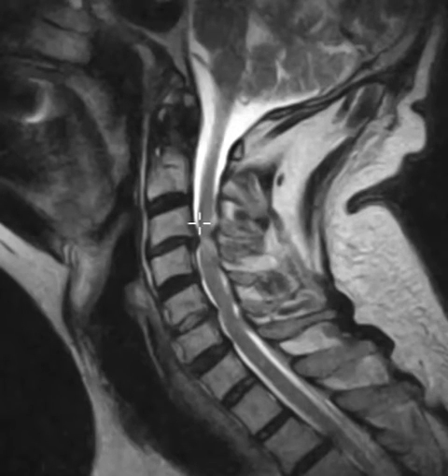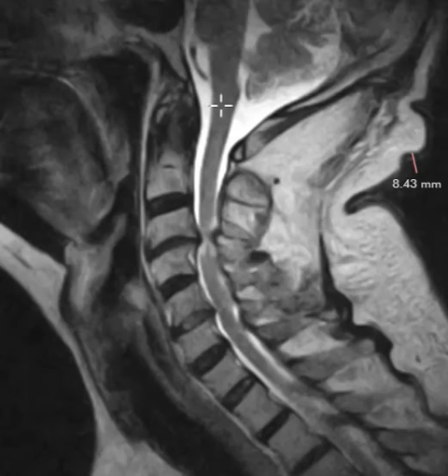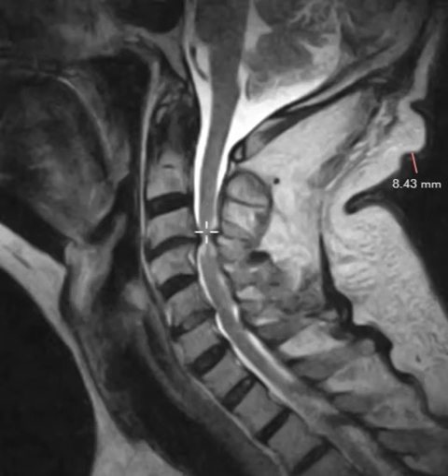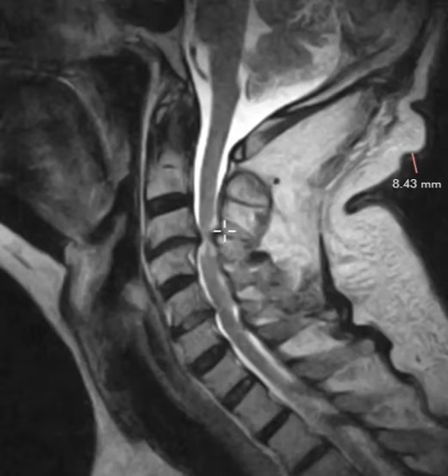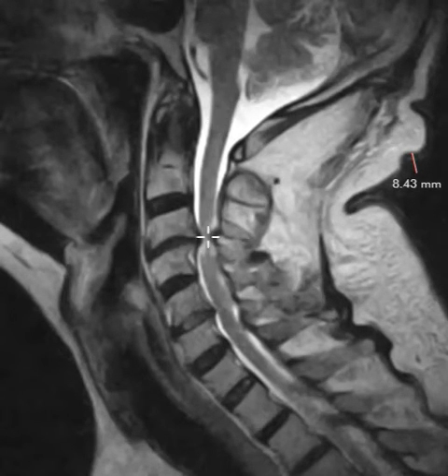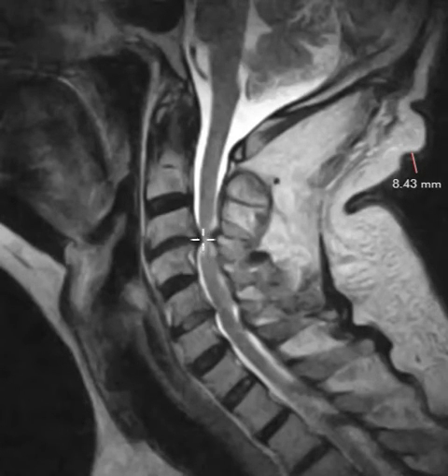This broad disc spur complex compresses the spinal cord — you can see how it's nice and thick here, but when we get down to here, it's very narrow. So this is a severe stenosis. The spinal cord is getting pinched, and also the spinal cord is smaller than it should be. Instead of being nice and thick, it has diminished in volume, so they have cord atrophy, and also some bright signal in the spinal cord, which is abnormal.